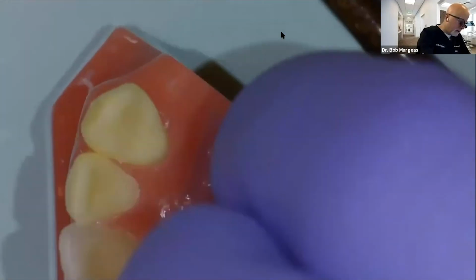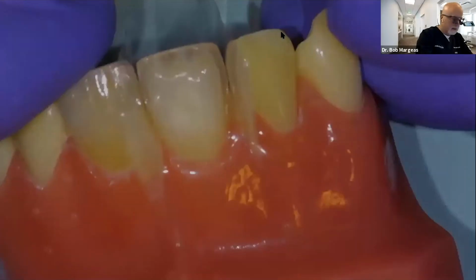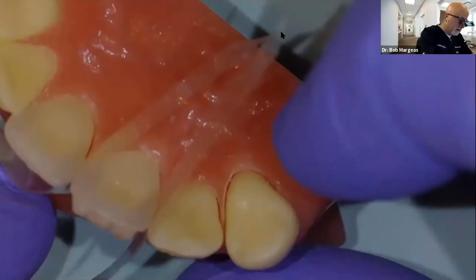You really want to make sure that you get the strip between the tooth and the gum. Let me center this here in a second. I got to get this strip in here, and then I'll show you what I got. Hard to keep that there like that without. Once I get it in here, I'll center that so you can see, because it's really critical to get under the gum. And with these plastic models, sometimes it's a little bit harder to get the strip under the gum.